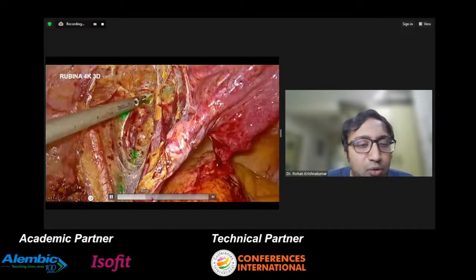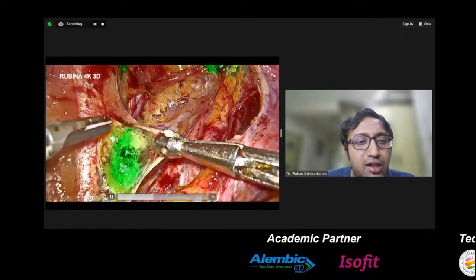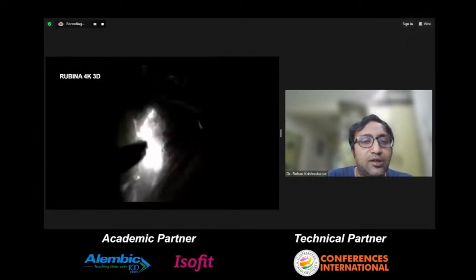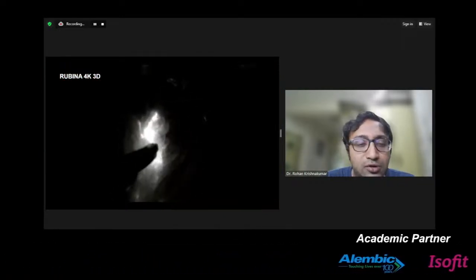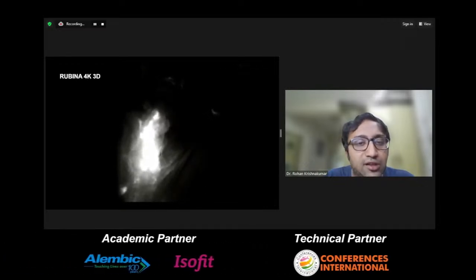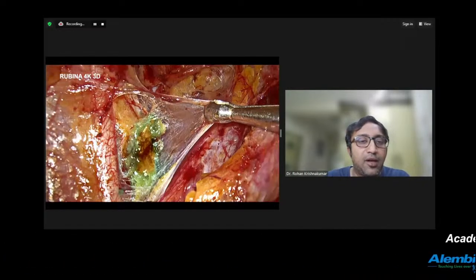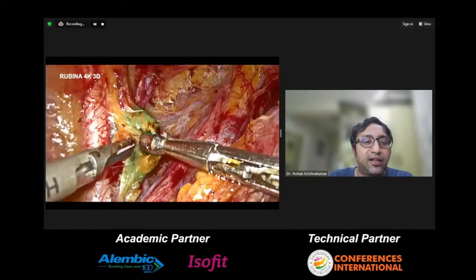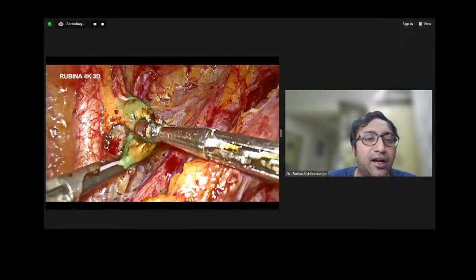You can see once you identify the node, which is usually over the external iliac vessel on 60% of occasions, you can see the color change from green to gray. The more the dye is concentrated in the center, the more it takes up this white color. So that's easier to identify whether you're exactly tracing ICG and it's not an artifact.